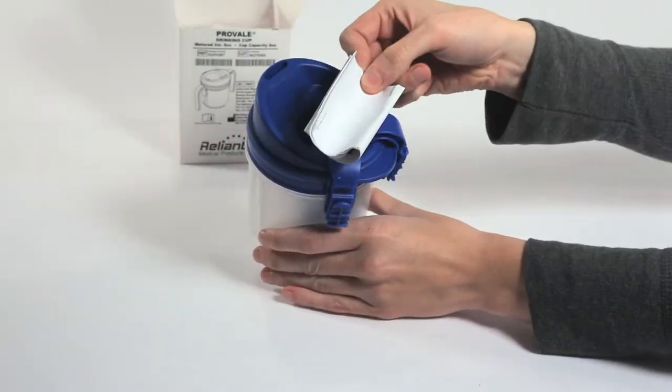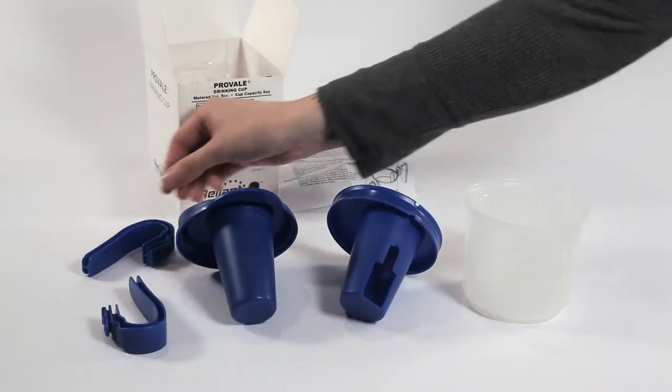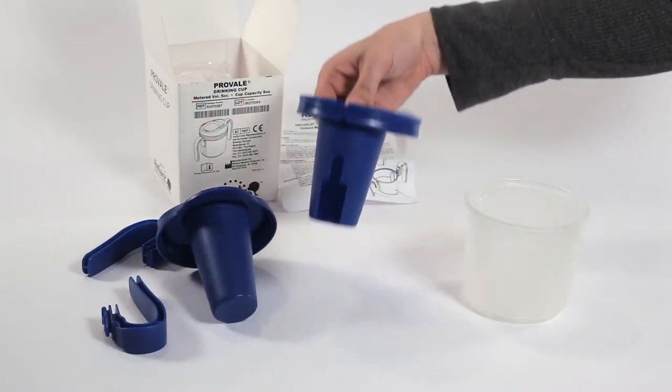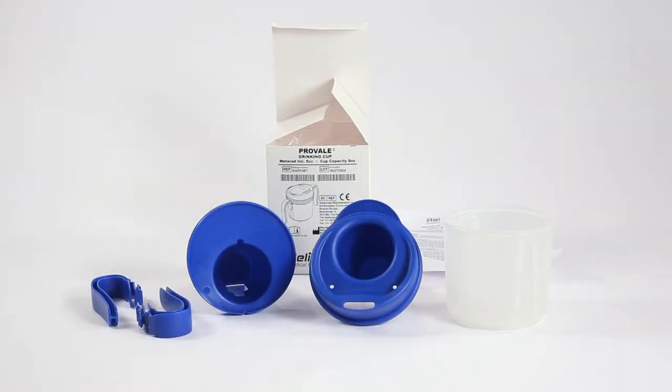The ProVail Cup has five individual parts and arrives unassembled: the two handles, the lid, the mid-cup, and the outer cup. To assemble the cup, simply follow these easy steps.